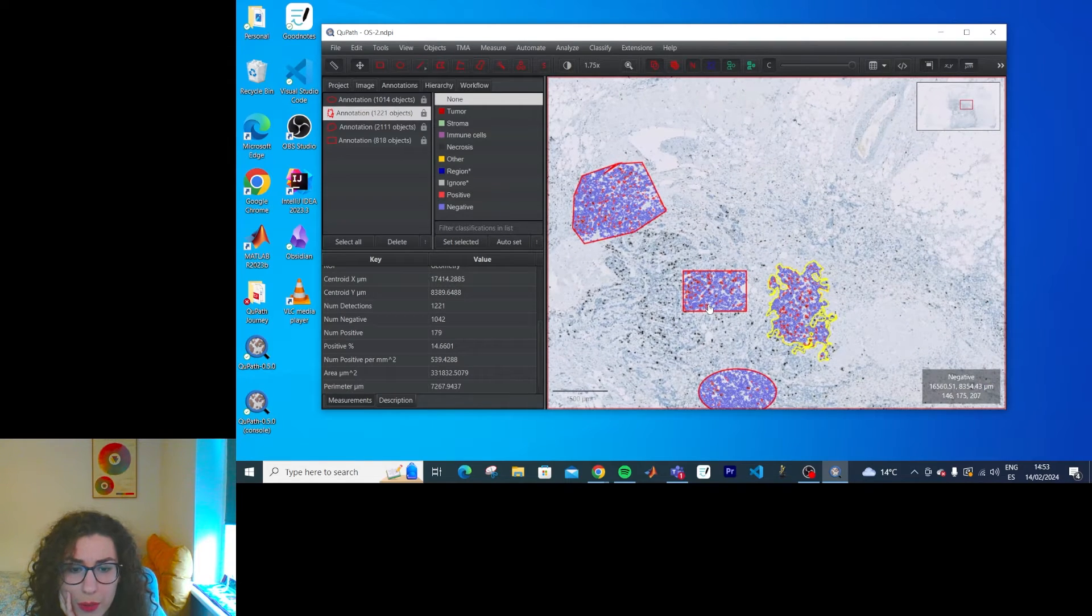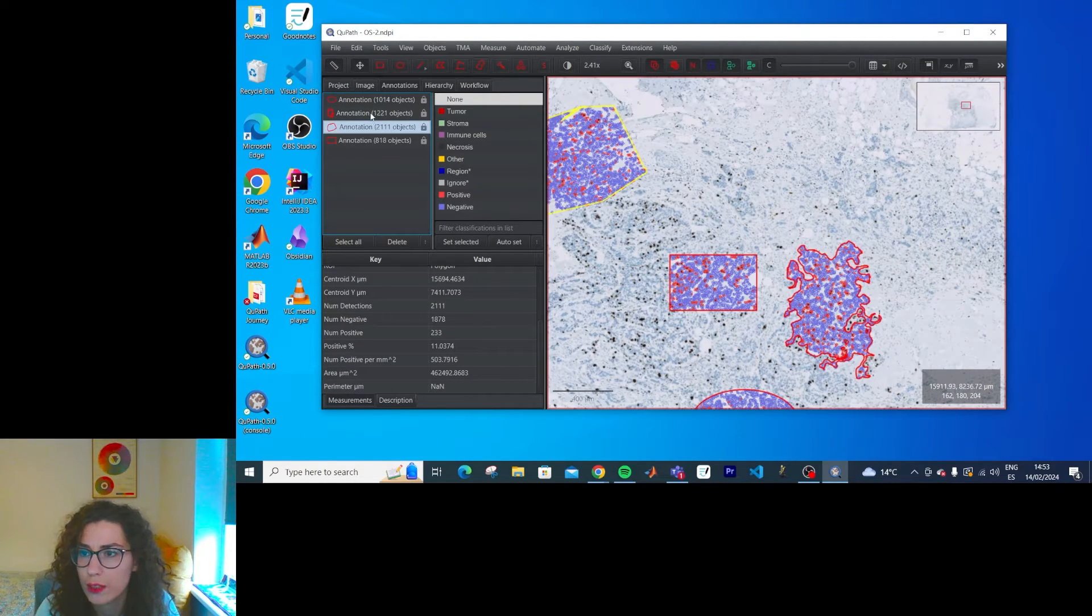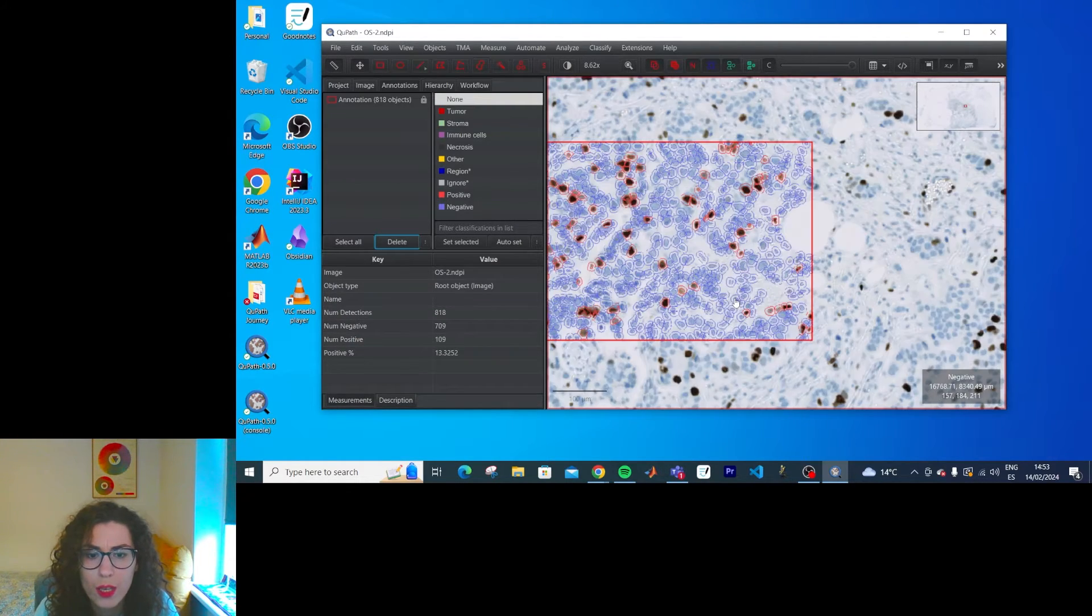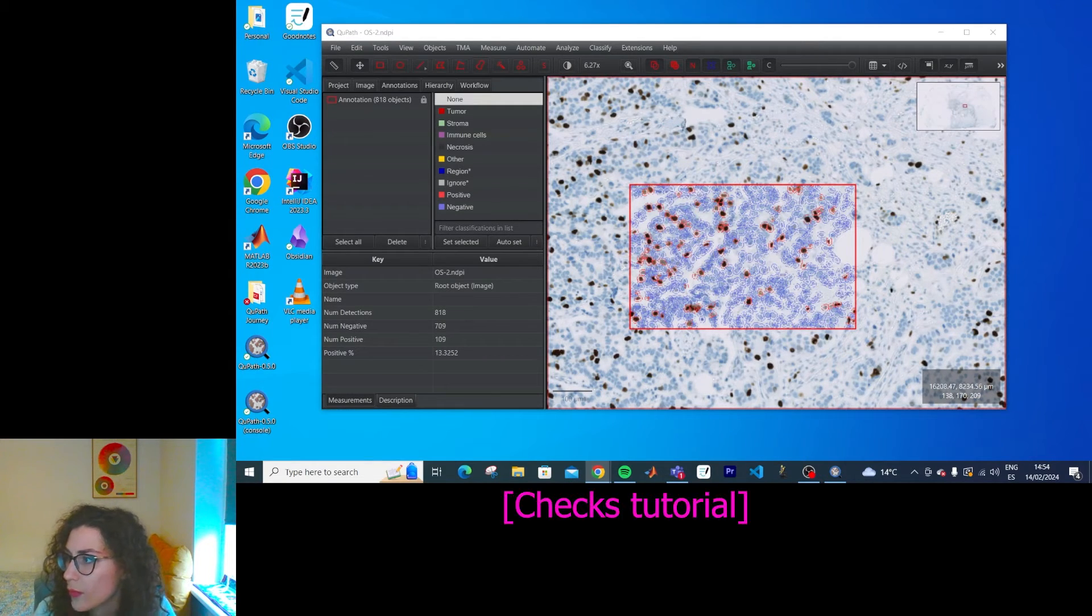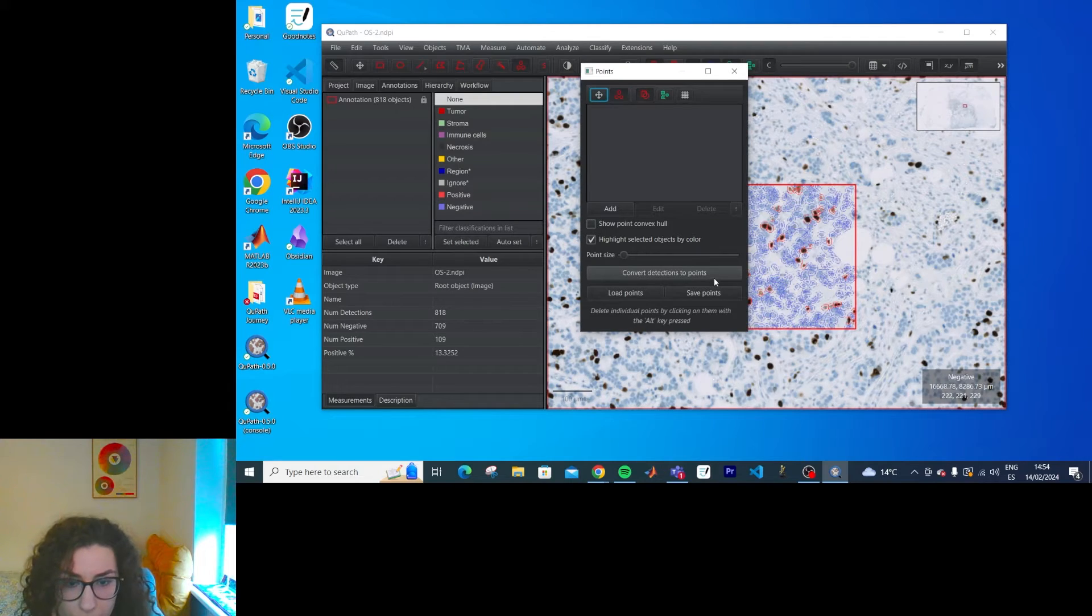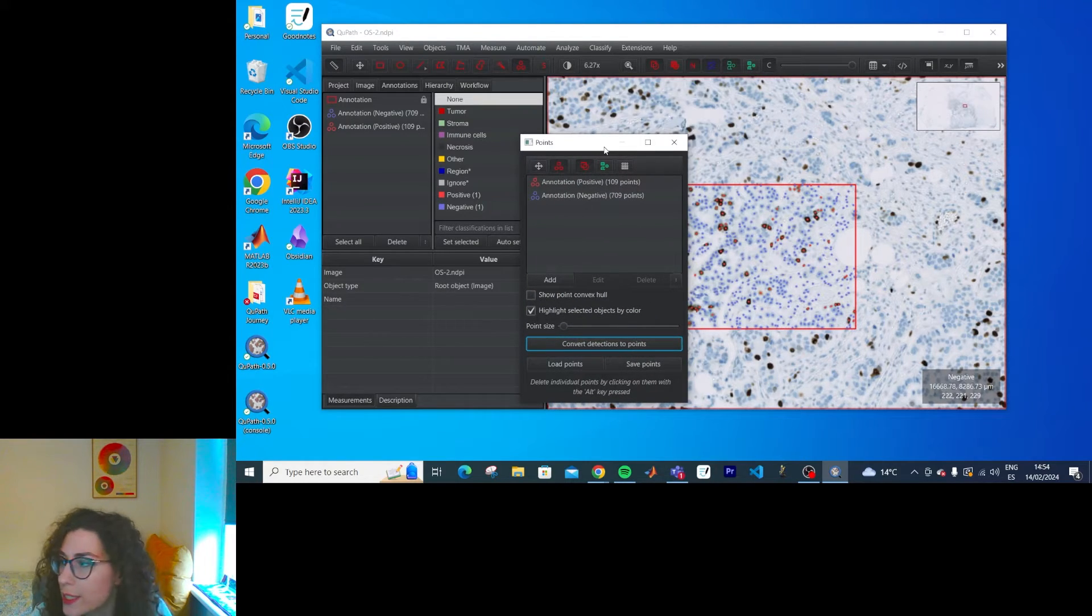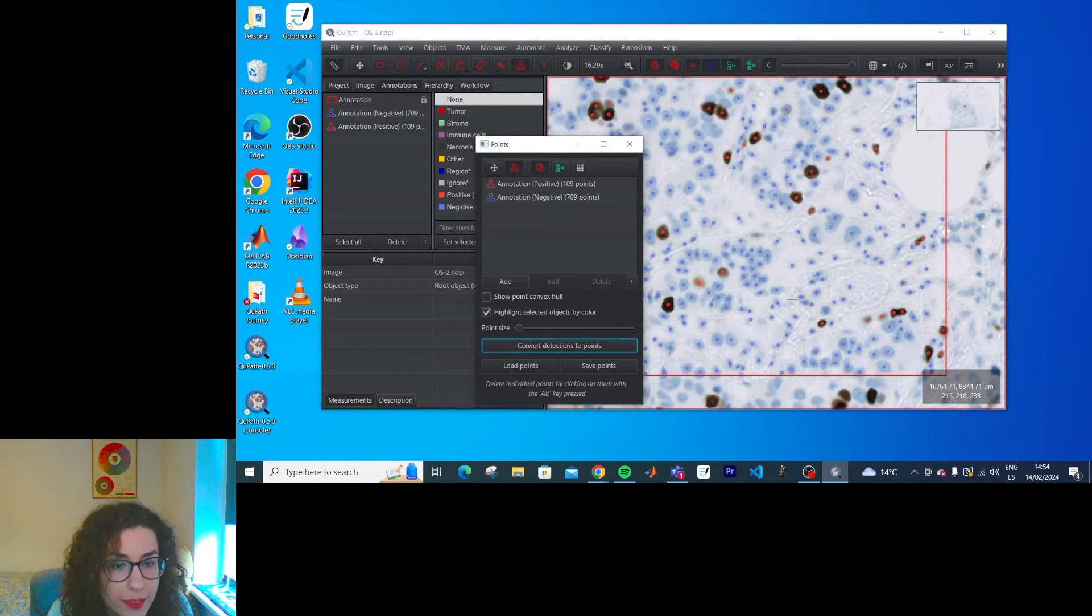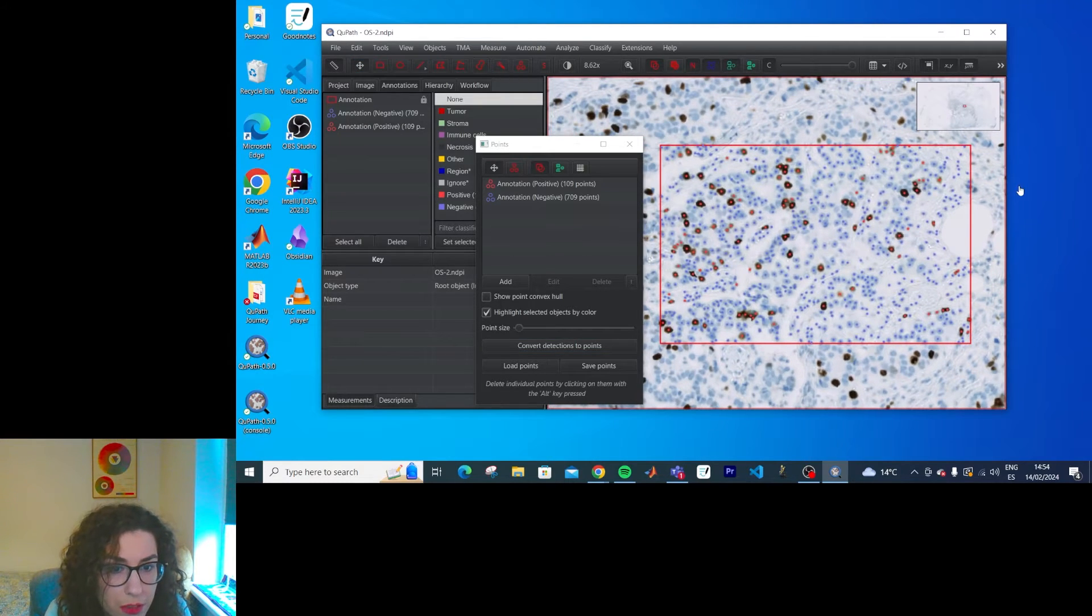So apparently if you want to have separate annotations, I'm going to delete the others. If you want to have separate annotations for each cell, you can do convert detections to points. And how do I do that? Here. Convert detection to points. Got it. Those are a lot of sections. Yes. Oh, and they're separated into negative and positives. I can see them better like this. Useful. Good.